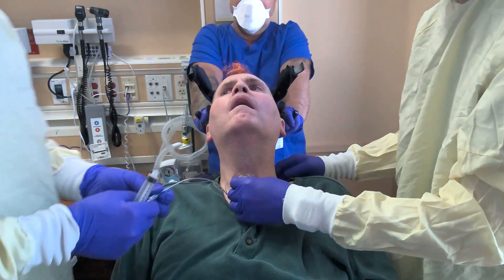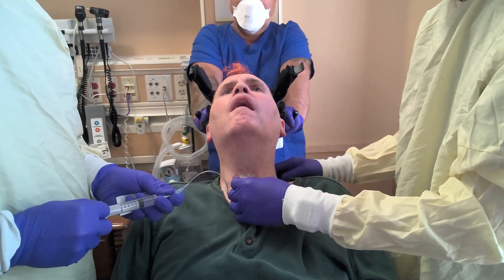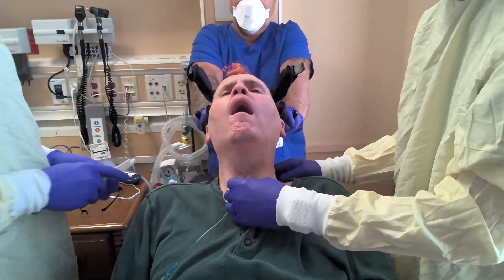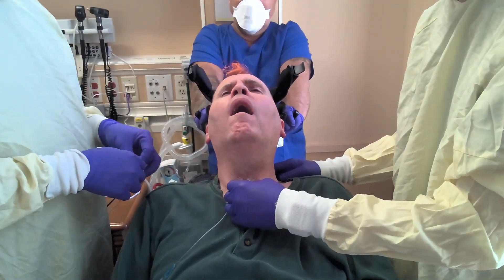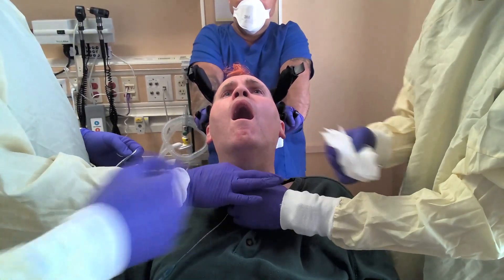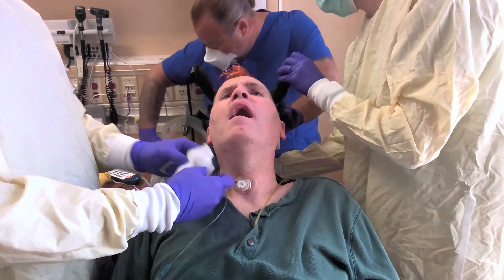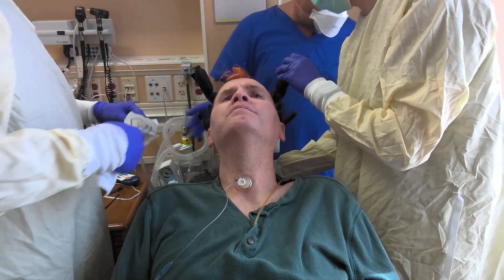I'm going to take all the air out of this cuff to shrink it down. This may make you cough a little bit, okay? Can I get a suction? I'll get you suctioned out here in just a second, okay. Do you need a suction kit, I'm assuming? You got it? I got it.